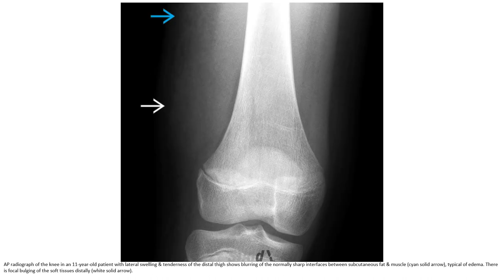This is an AP radiograph of the knee in an 11-year-old with lateral swelling and tenderness, showing blurring of the normal fat-muscle interface between subcutaneous fat and muscle, with displacement of the soft tissue planes.